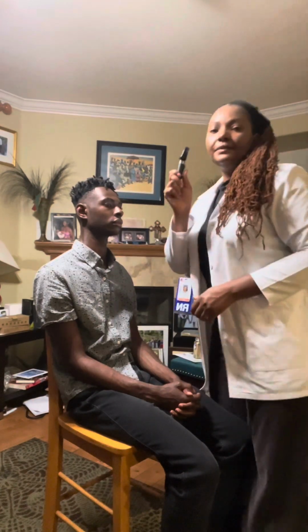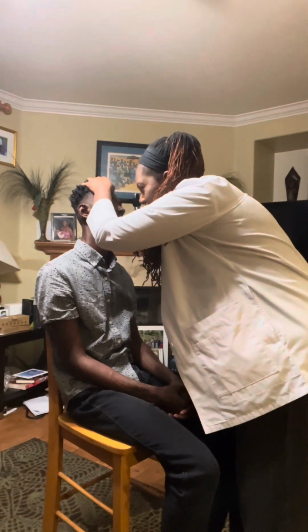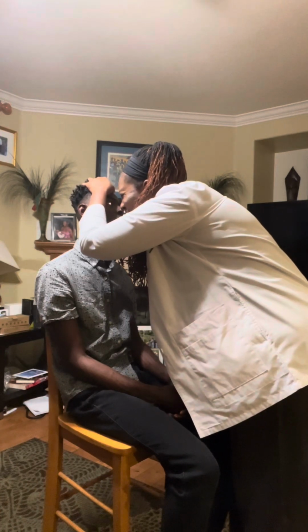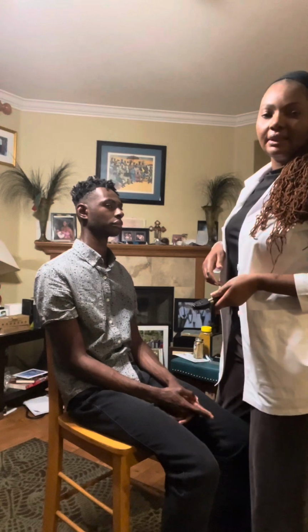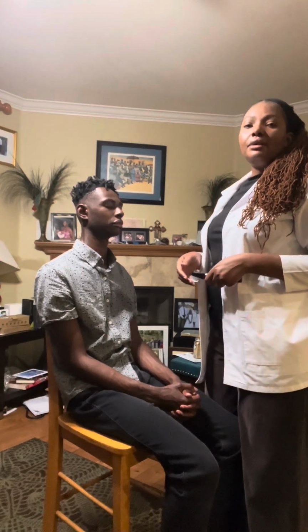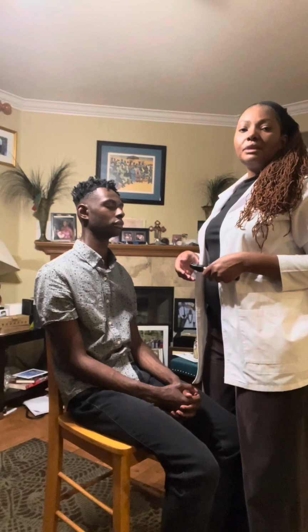And now the left eye, with my left hand, and the patient's left eye. So I am going to look at the optic disc in the eyes. Normally you see the optic disc has a sharp margin, yellow, orange, creamy, and the cup to disc ratio is 1:3.